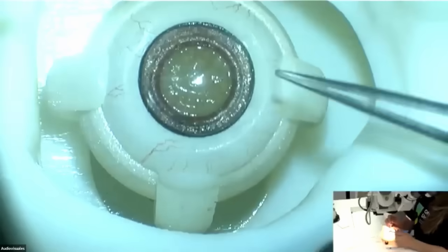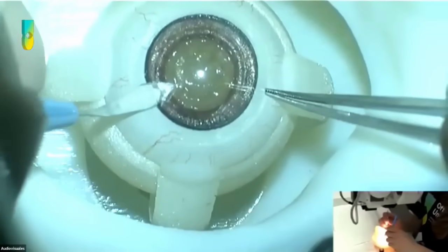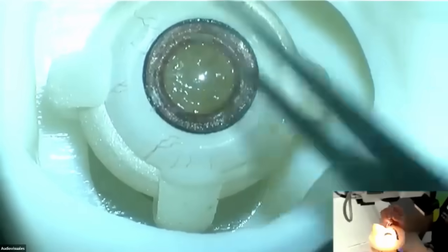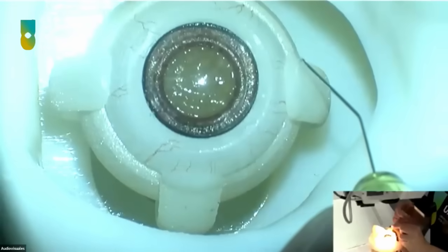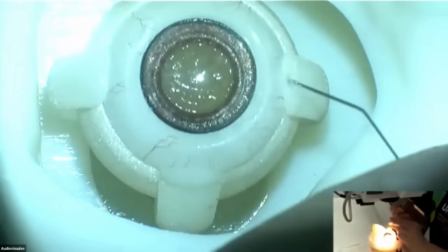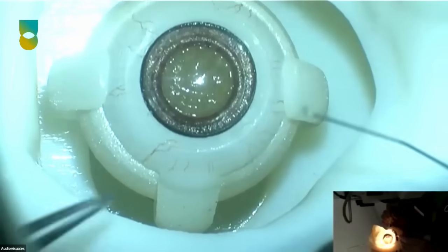Cecilia, are you there? Yeah, I'm here. I was muted. So the first is you start with peribulbar anesthesia, holding the eye with the forceps. But I think that when you go to topical anesthesia, you have to change your way and not use forceps anymore. I know that there are many opinions on this, but I use a cotton swab just to hold the eye. That's very gentle, because when you take the eye and fixate it with the forceps, the patient feels it, and the patient starts to move.